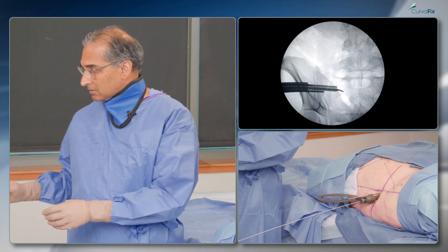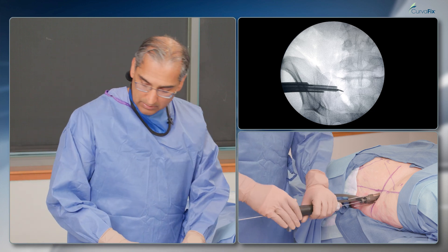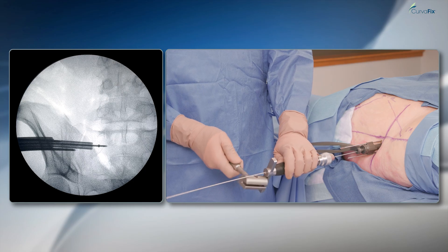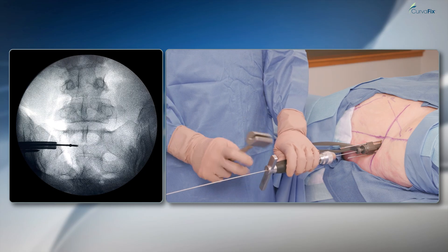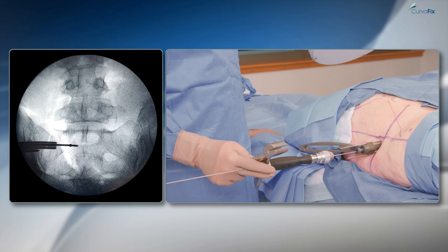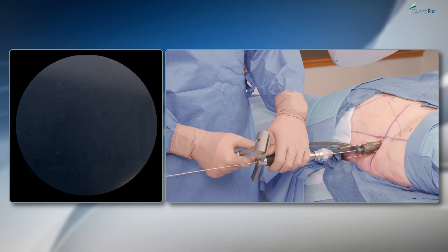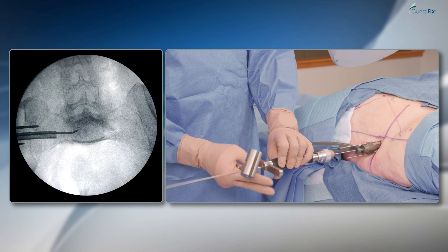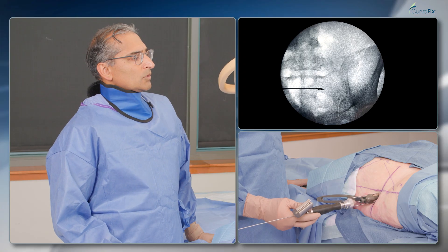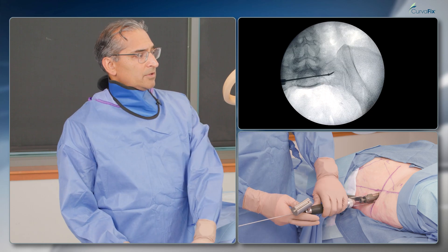I'll take the T-handle and a mallet. I'm going to be careful getting around there. Going straight now — that's two posterior on the inlet view, so I'm going to rotate that to go anterior. You can see the S1 tunnel there — I'm above the S1 tunnel on the far side and safe there as well, so I'm going to tap that in a little bit more.